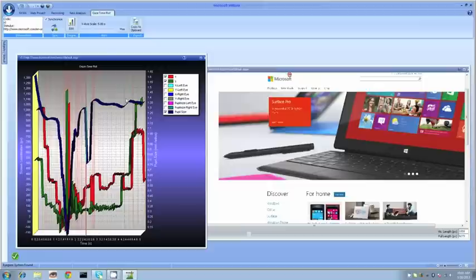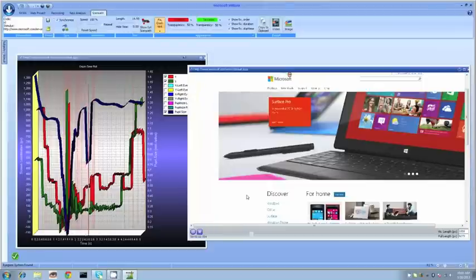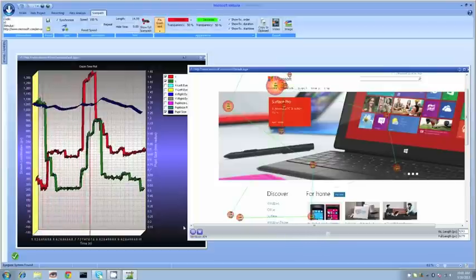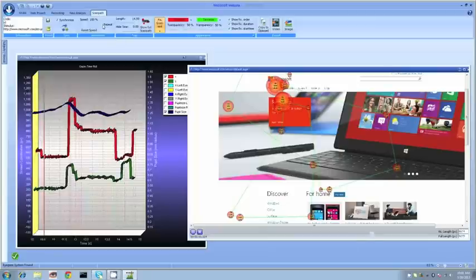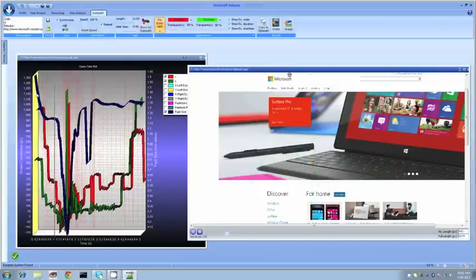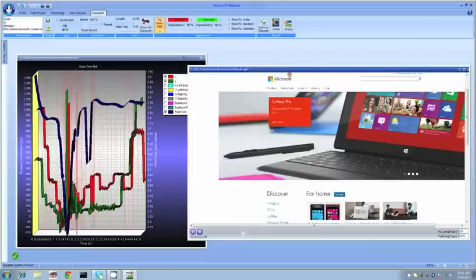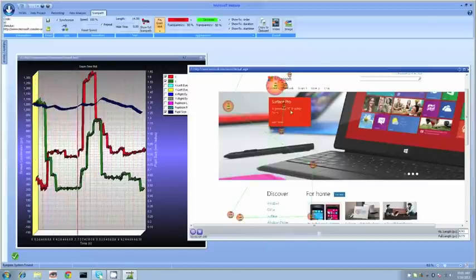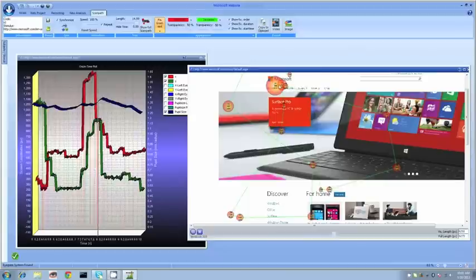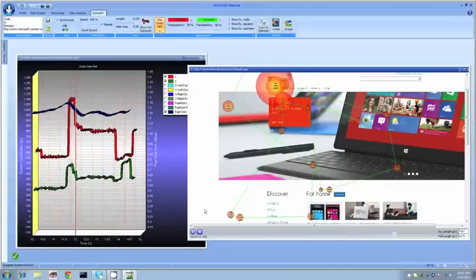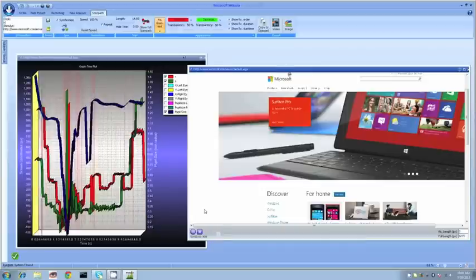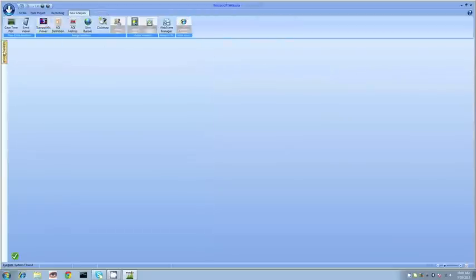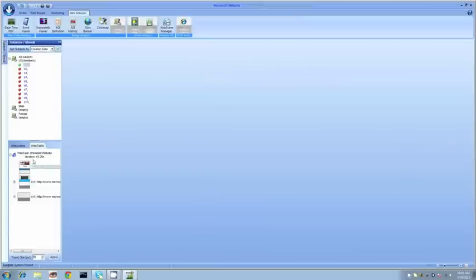We'll synchronize this data as well. I'll click this synchronize button, and once I play this, you can see on the screen both the eye information, the pupil information, as well as all the fixations and saccades taking place in that video playback. All this information is exportable. You can digest this information in real time, play it back, compare this to multiple subjects. There's a lot of things we can do here. Very neat measurement to see pupil information - we can break it down by each eye individually or both eyes combined.